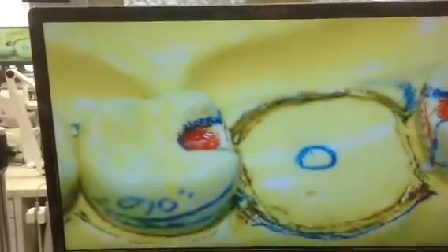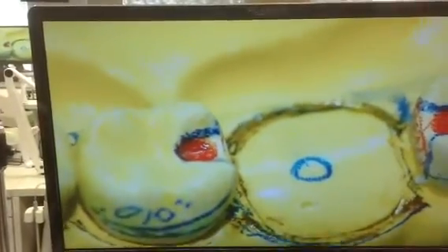Tube teeth. We've had lots of controversies over tube teeth. So faculty can listen to this too. A tube tooth is generally only held in place by this post that's in the middle, and it is surrounded by metal. The tooth is actually precision fit to go right into that slot of the framework.